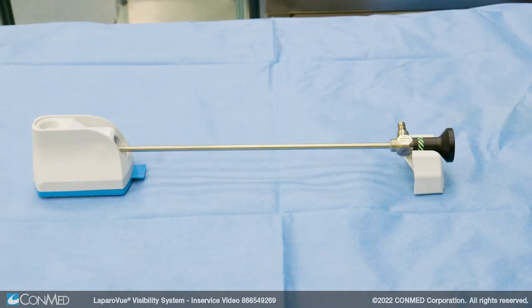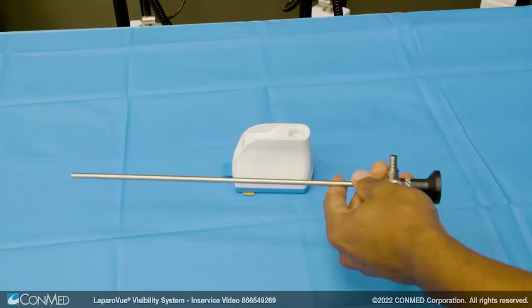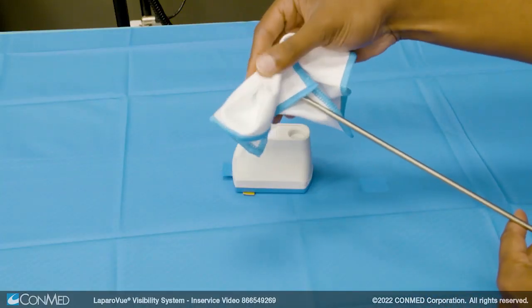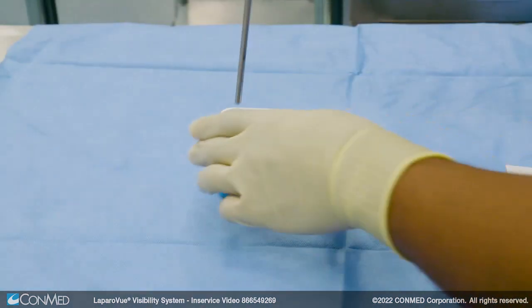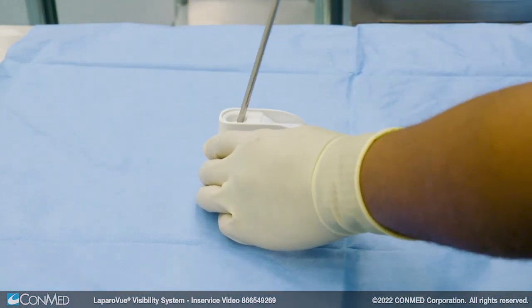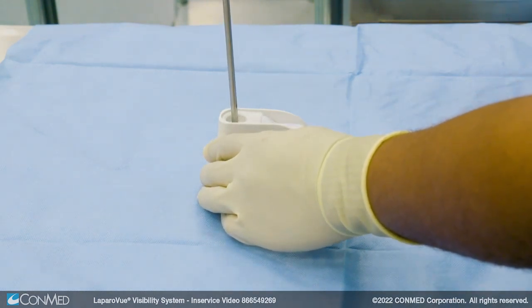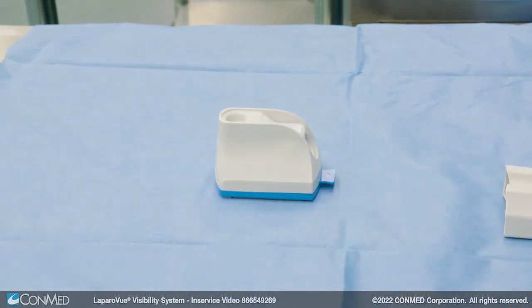If the scope needs to be cleaned during the case, use the vertical port. This cleans and defogs the scope. First, use the microfiber cloth to remove excess debris before insertion into the vertical port. Then insert the scope into the vertical port and gently rotate the scope back and forth. Laparovue provides both a chemical and physical clean, which results in a clear image for the surgeon.